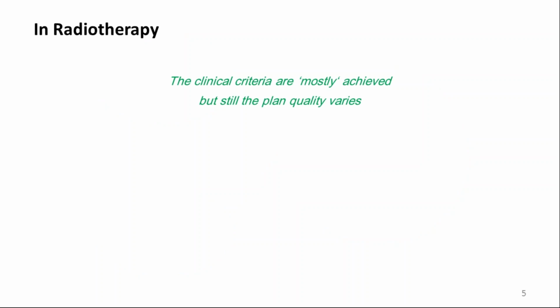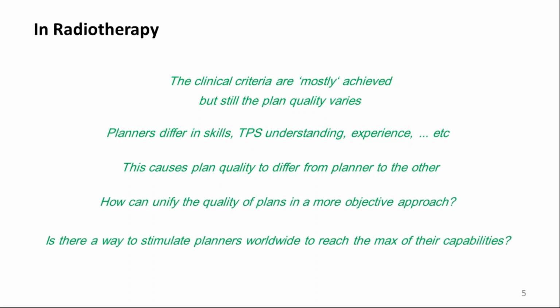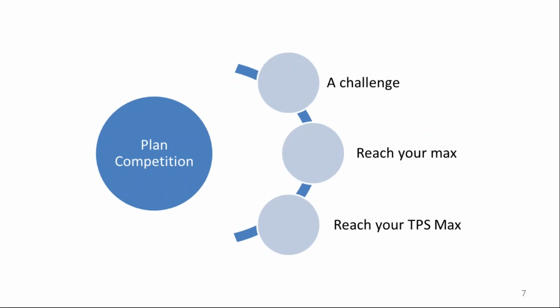Now, in radiotherapy, the clinical criteria are mostly achieved, but still the plan quality varies. Planners differ in skills, treatment planning understanding, experience, etc. This causes the plan quality to differ from one planner to the other. Now, how can we unify the quality of plans in a more objective approach? And is there a way to stimulate planners worldwide to reach the maximum of their capability? The answer to this last question is through a plan competition.